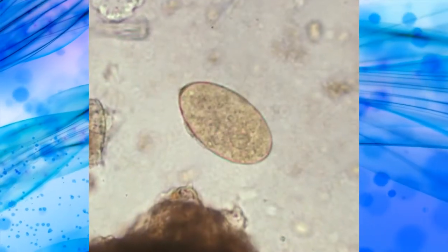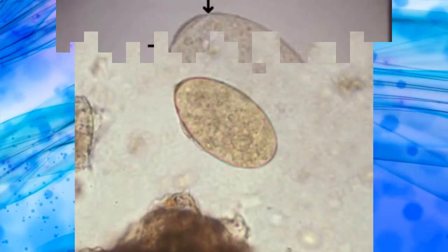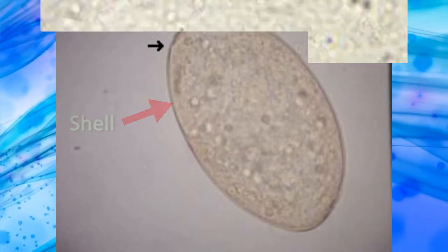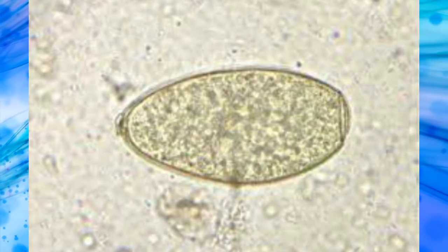The eggs are unembryonated when passed in feces. The shell is smooth and fine with a double line. Color ranges from yellow to dark brown.